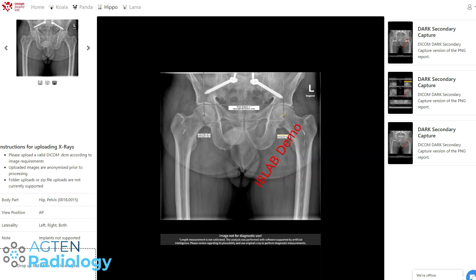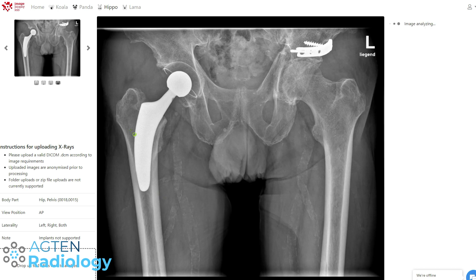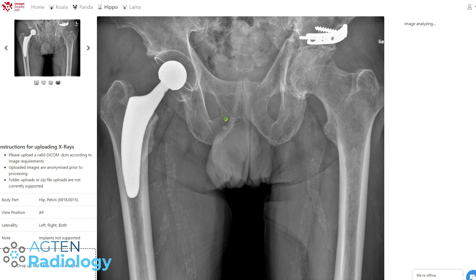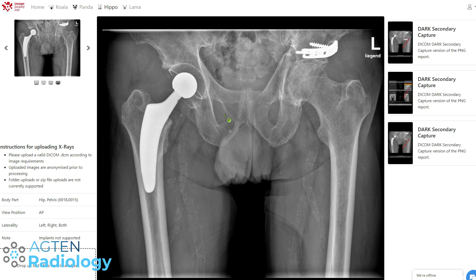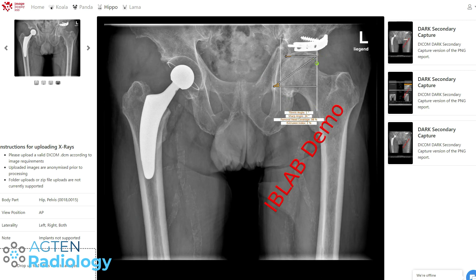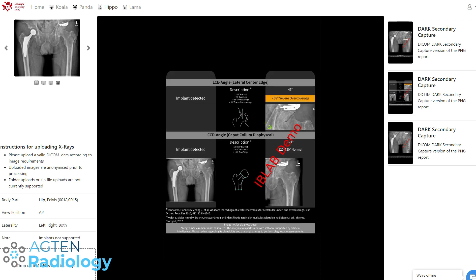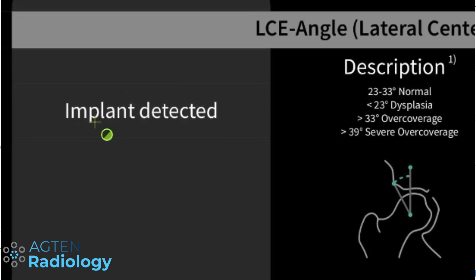Let's try the next one. This one has an arthroplasty on the right side, so it should not work. I think it's really important that machine learning systems figure out on their own if the cases they receive are actually appropriate — to avoid errors. Let's see: it does measurements on one side only — that's already a good sign. No measurements on the arthroplasty side, so it obviously recognized the arthroplasty. It even says 'implant detected.'